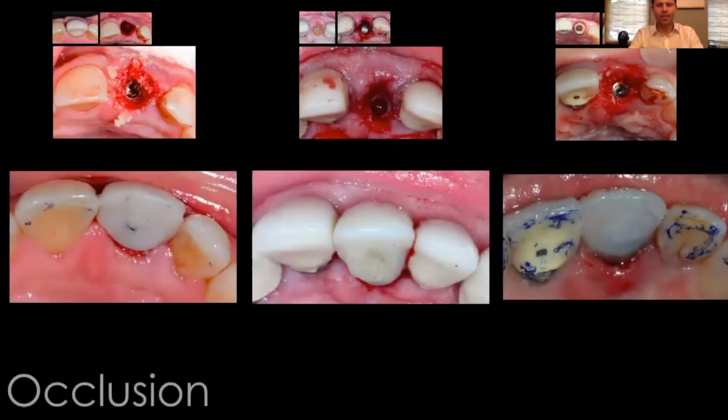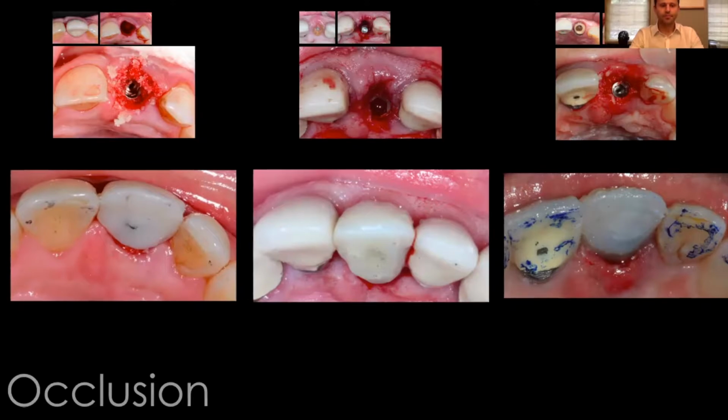And having the right occlusal schemes, so that you're making sure that there's absolutely no excursive movements, anterior, posterior, sliding back and forth, that there's absolutely no touching of this implant temporary crown. And so you relieve all of it, all the prematurities. As you can see, you use articulating paper and you let it heal. Take an X-ray, either at 6 weeks, 3 months, and you look.